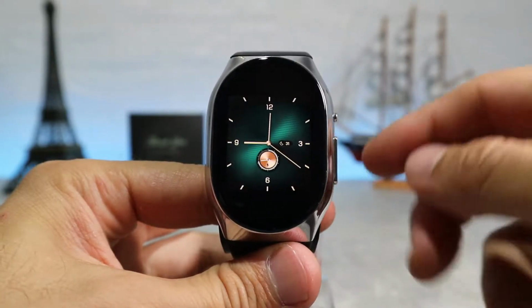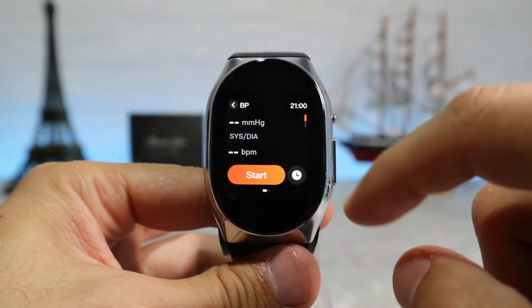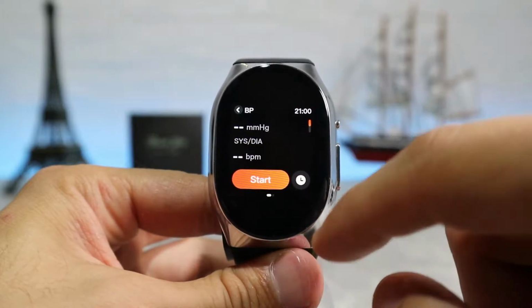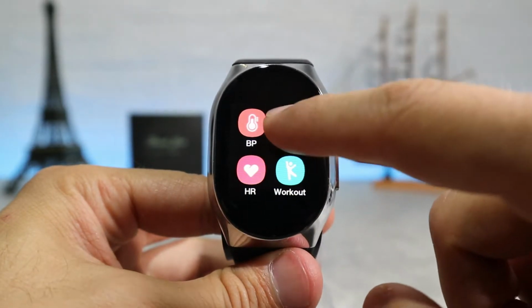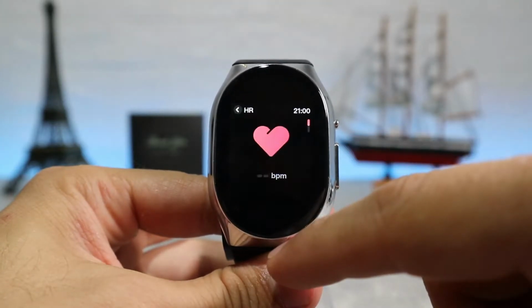When you press the button, it will show you the main menu with all the apps inside, which right now are in a list view. Blood pressure is obviously the blood pressure monitor function with a standard mode that will synchronize to the mobile app to keep a history of measurements. SpO2, or oxygen saturation level, is said to be normal at 95 to 100%. The data can be used to detect sleep apnea.